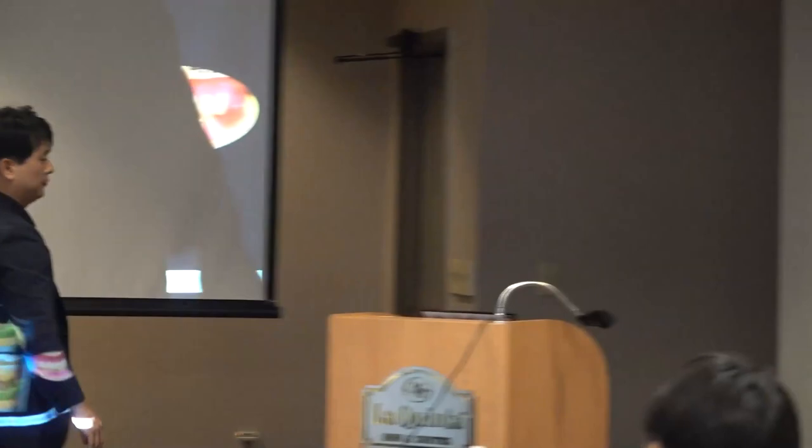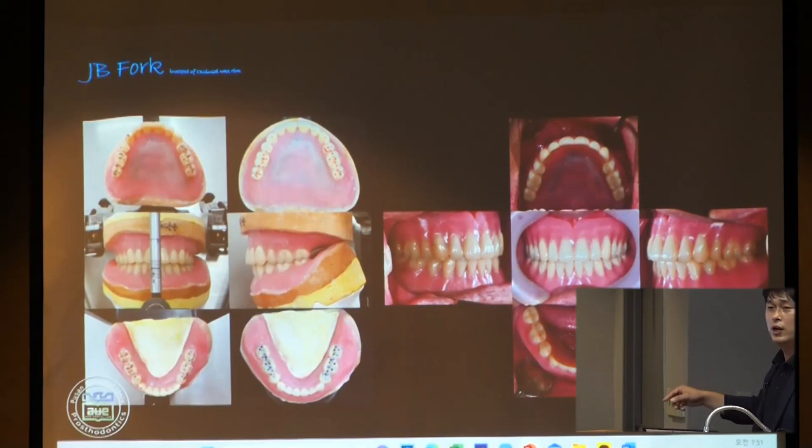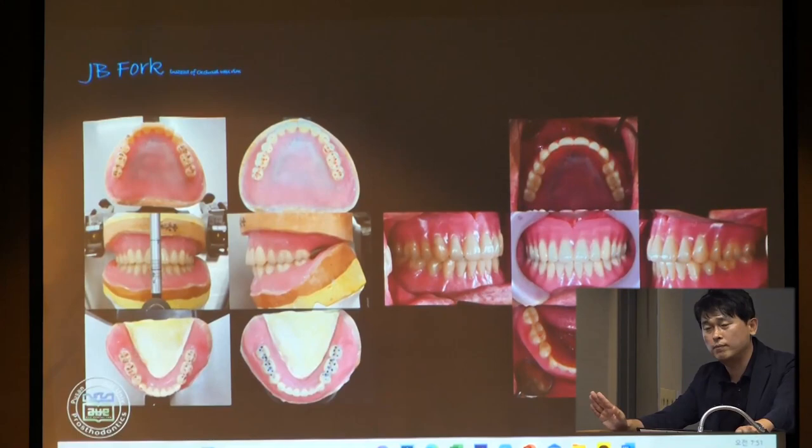retromolar pad, right? The middle height of the retromolar pad indicates the lower posterior reference of the occlusal plane. So you can put the artificial teeth according to those references. Okay? Anyway, after positioning, finish the try-in dentures, and then make the final denture. Although you use the conventional denture procedure, you can reduce one step of occlusal wax rim adjustment. Okay.